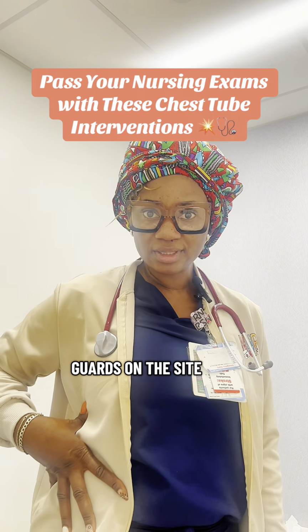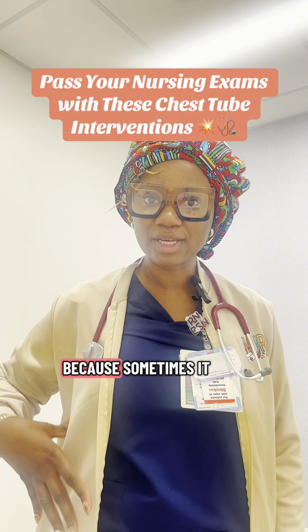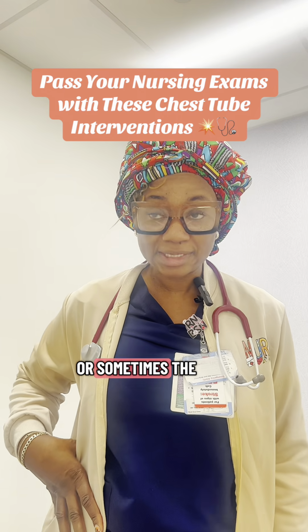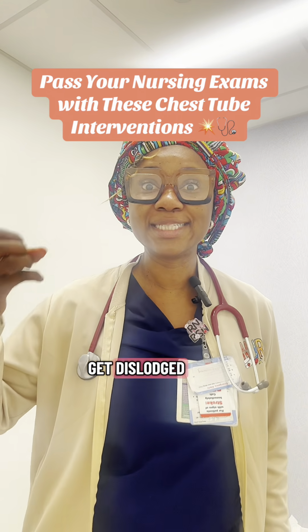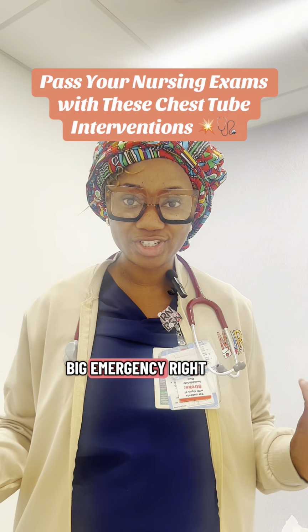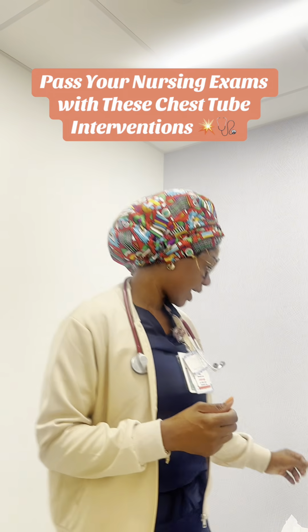There will be gauze on the site. Is it draining? Is it dry? Make sure you assess because sometimes it can be leaking and you have to know what's happening. Or sometimes the chest tube will get dislodged. When it gets dislodged, it's a big emergency, right? What do you do when the chest tube gets dislodged?